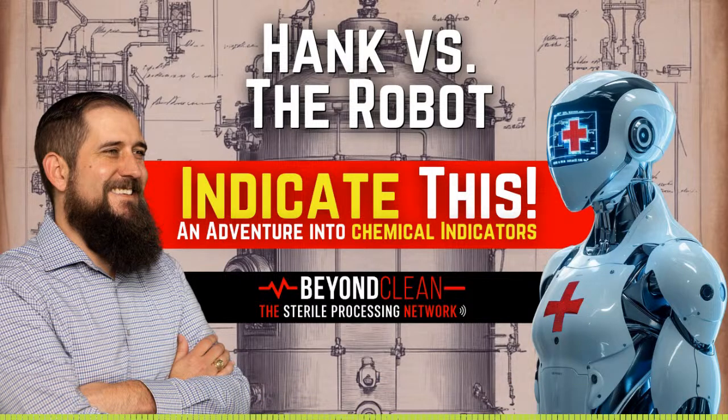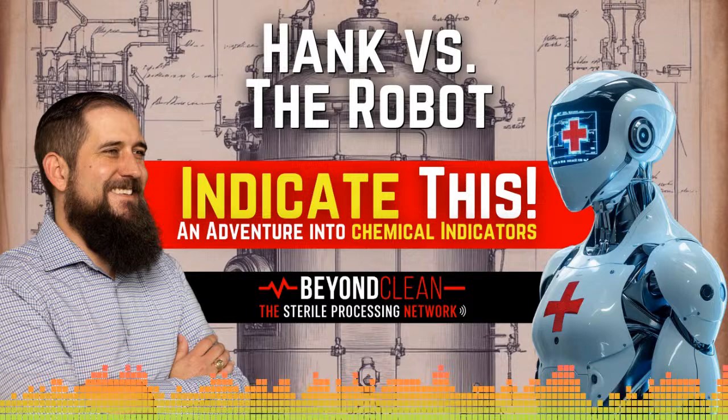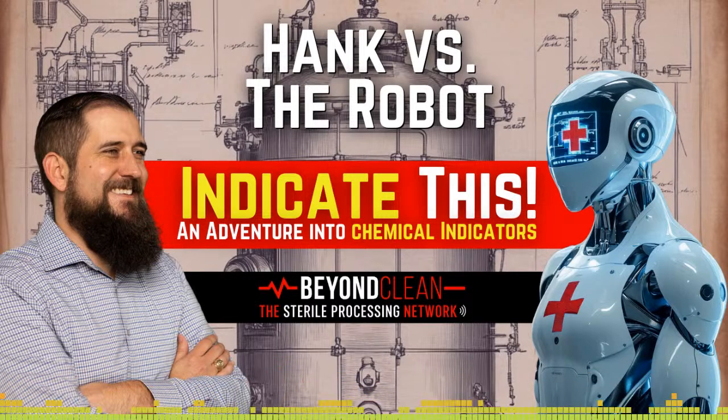The drawbacks of color change. One, subjectivity. Not all color changes are clear-cut. A faint or incomplete change can lead to misinterpretation. One tech might see a pass, while another might call it a fail. Two, environmental factors. Lighting conditions in the SPD can affect how colors appear. A poorly lit workspace, or even techs with color vision deficiencies, can miss subtle changes. Three, limited precision. Color change alone doesn't convey nuanced information about the sterilization process. For instance, it can't tell you how close the process came to meeting the parameters. It's binary, pass or fail.